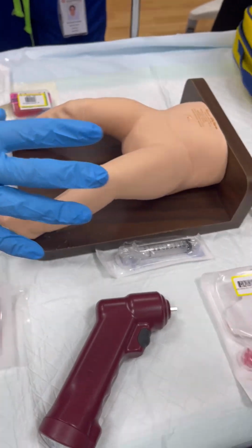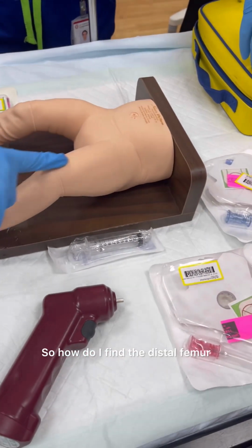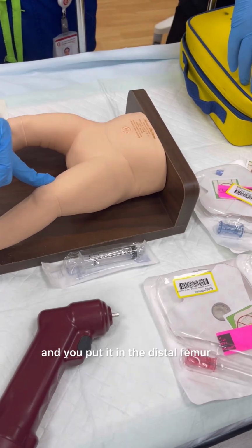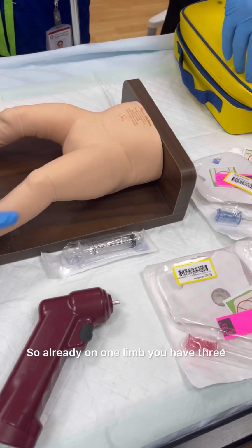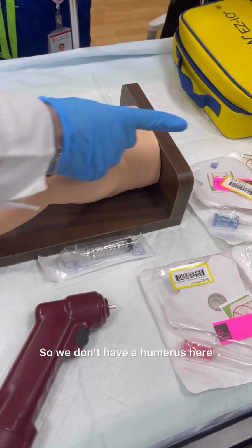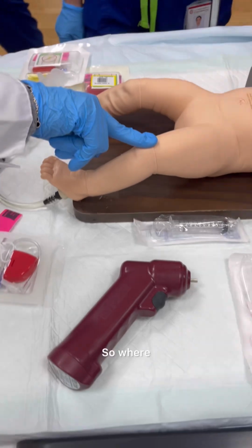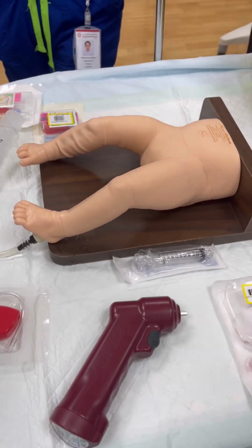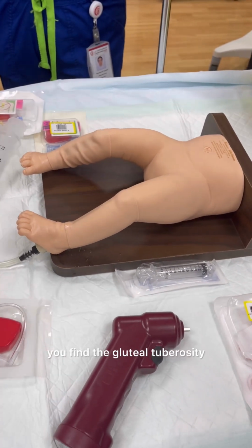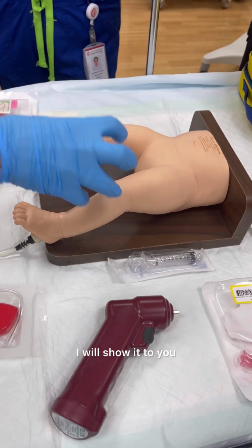So these are two sites. Any other sites? The distal femur. How do I find the distal femur? I go down, find the knee, and go medial to the knee, and you put it in the distal femur. So on one limb, you already have three sites. What if the limb is gone? The proximal humerus. We don't have a humerus here. Do you know the landmark of the proximal humerus? The greater tuberosity. Above or below? Above. You find the shoulder, then go down and find the greater tuberosity, and the site is above it. Most people will use the tibia.